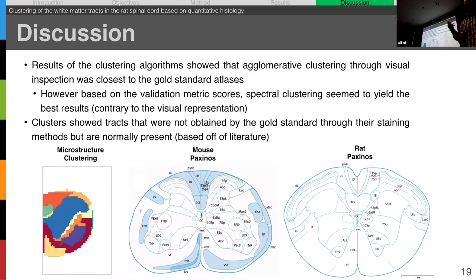I think the quantitative metric map is really what makes it more feasible for the clustering, because it's based off the variation of, let's say, axon diameter and so on, which varies throughout the spinal cord. It's really looking at those variations and differences to give us the clustering outputs. So I think the quantitative metric maps would be more feasible. I don't know if it'd be possible to do it just based off intensity. I actually don't think so, because the metric map would mostly be segmenting the diameters of the axon and the myelin. So it'd essentially be looking at only one metric, for example, the diameter. Right. So you're basing on some parametric measures that you extract from the segmentation. Right, exactly. So it's kind of indirect.